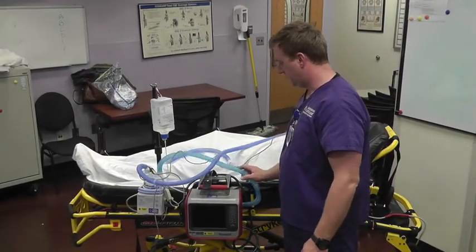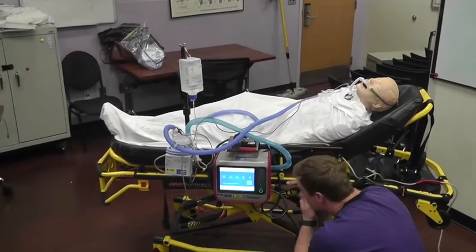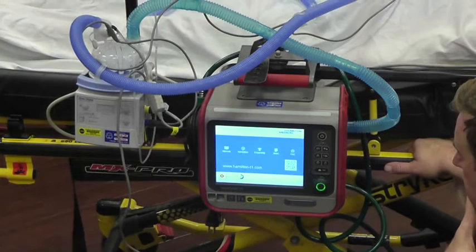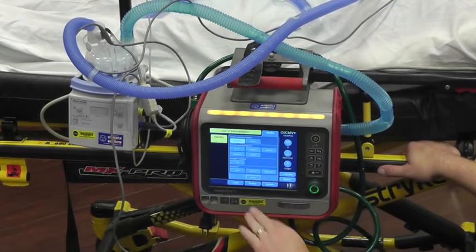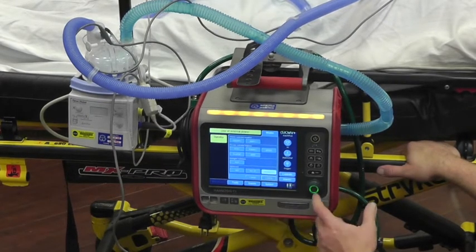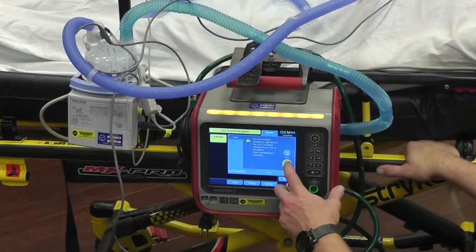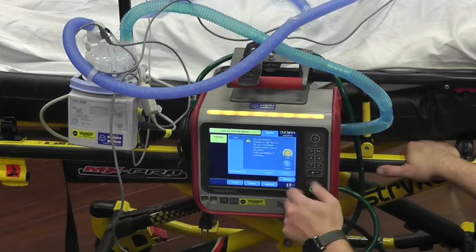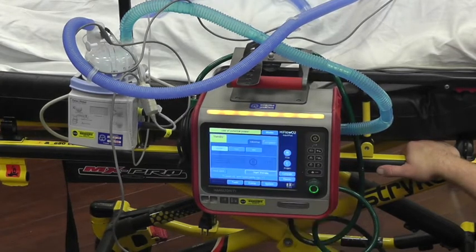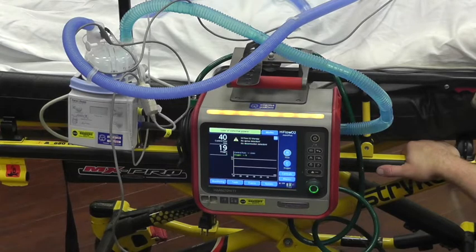Next, we've got to set the ventilator up. Go ahead and turn it on, then hit Modes. In the same line as the non-invasives you'll see NIV, NIV-ST, and then High Flow O2 — click on High Flow O2 and confirm it. You'll get your settings: a flow rate and an oxygen percentage. Set oxygen to 21% just so it doesn't alarm, and set flow to 40 liters. Hit Confirm. Just like any other mode, it takes you back to the front screen — hit Start Therapy, and it's that easy. You don't need an expiratory valve or a flow sensor, just this setup.